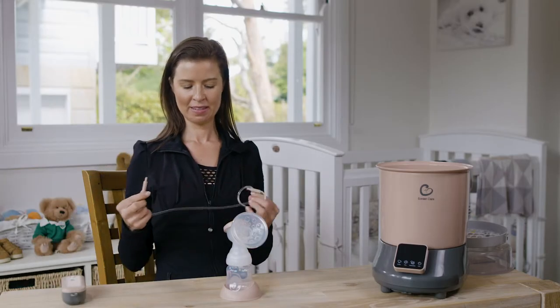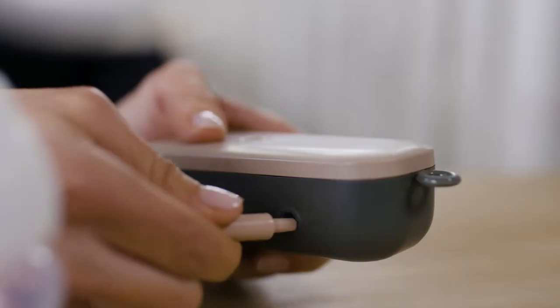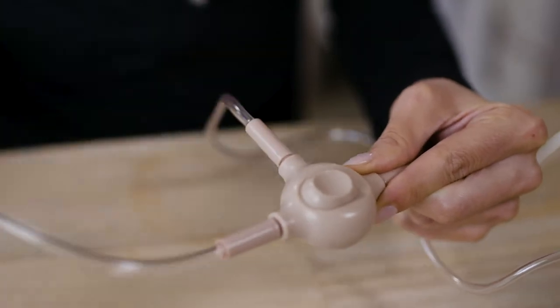To connect to the motor, insert the air tubes. And if you are using the double-sided pump, connect the two longer air tubes using the tubing adapter.